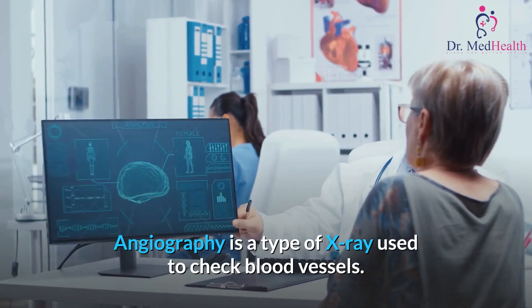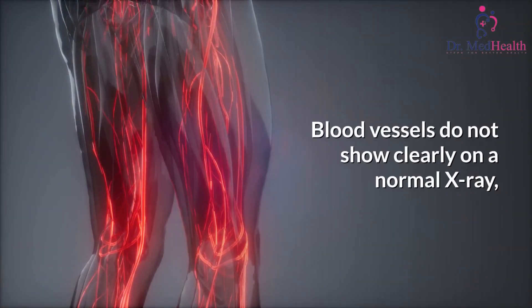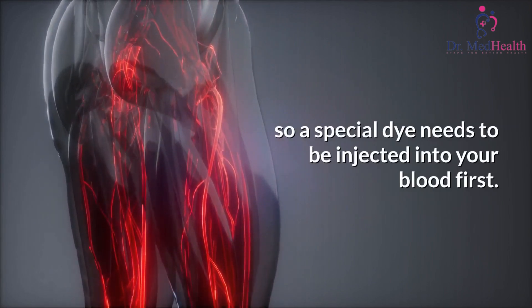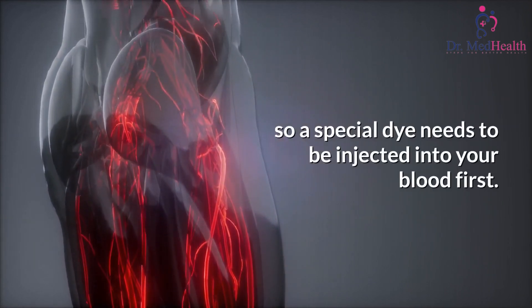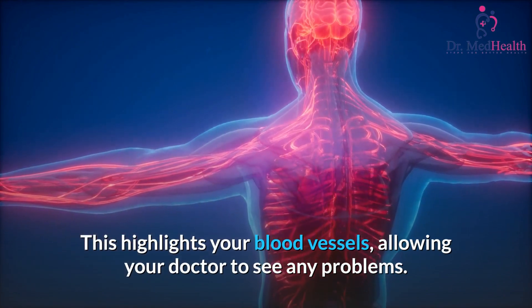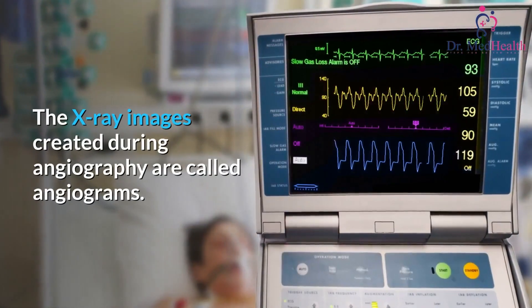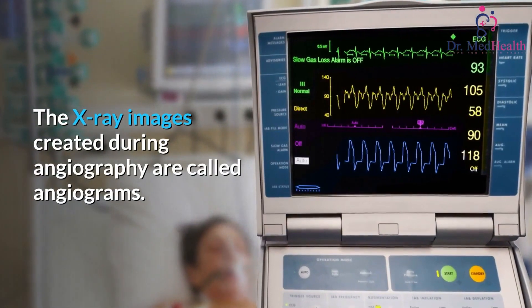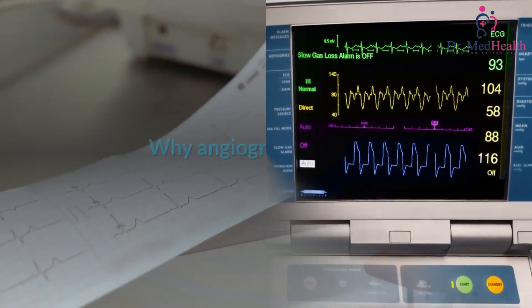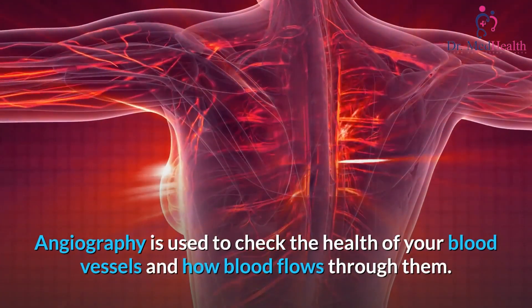Angiography is a type of x-ray used to check blood vessels. Blood vessels do not show clearly on a normal x-ray, so a special dye needs to be injected into your blood first. This highlights your blood vessels, allowing your doctor to see any problems. The x-ray images created during angiography are called angiograms.